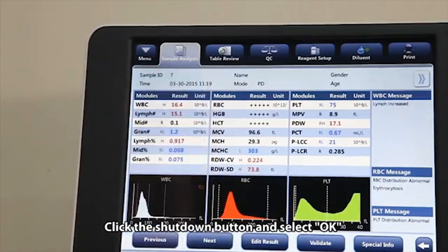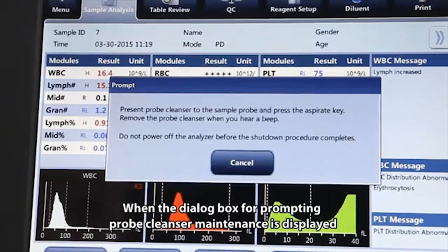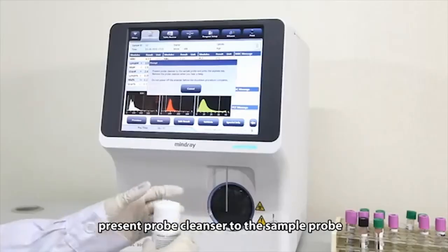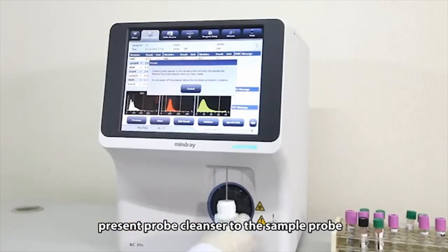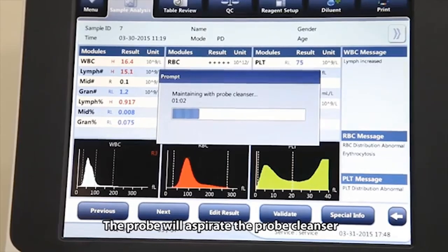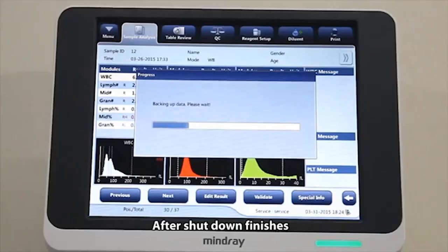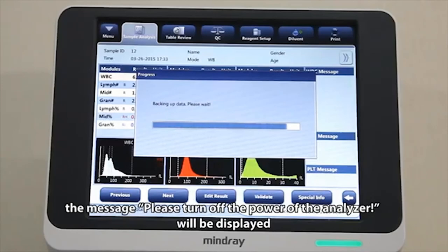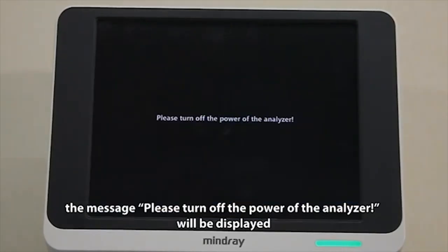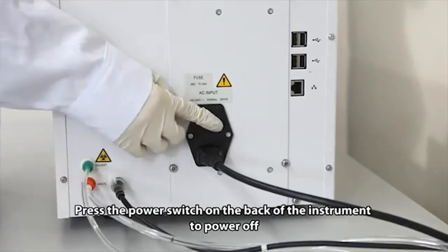Click the shutdown button and select OK. When the dialog box for prompting probe cleanser maintenance is displayed, present probe cleanser to the sample probe, then press the aspirate key. The probe will aspirate the probe cleanser, then BC30S will clean the whole system automatically. After shutdown finishes, the message, "Please turn off the power of the analyzer," will be displayed. Press the power switch on the back of the instrument to power off.